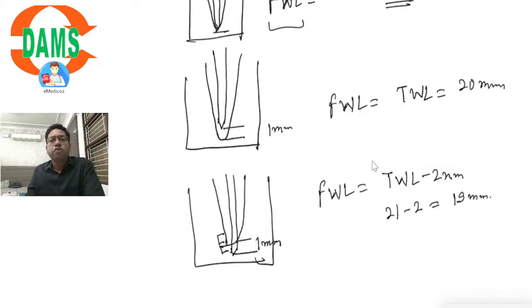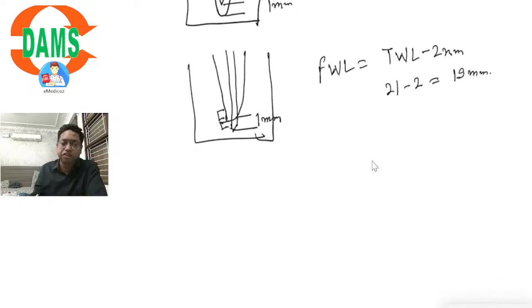So this is how we assess the Ingle's method to determine the working length in a radiographic manner. What you have to remember, the distance between the tip of the file and the radiographic apex should be 1 millimeter. And if it is so, it would be the final working length. I have given you 3 examples of clinical situations. The clinical situations and the dimensions may vary. Accordingly, you have to adjust and make the distance between the file tip and the root tip 1 millimeter. This is the Ingle's method of working length determination. We talk about the electronic apex locator, which is a non-radiographic method.